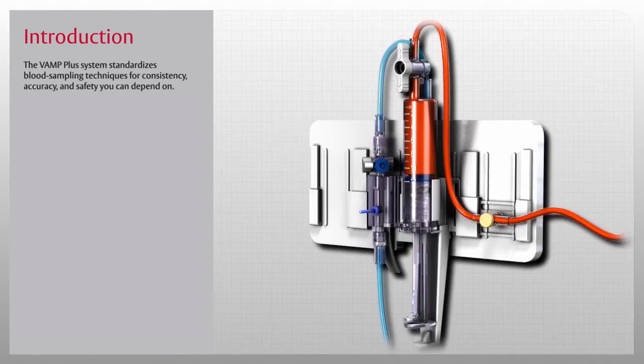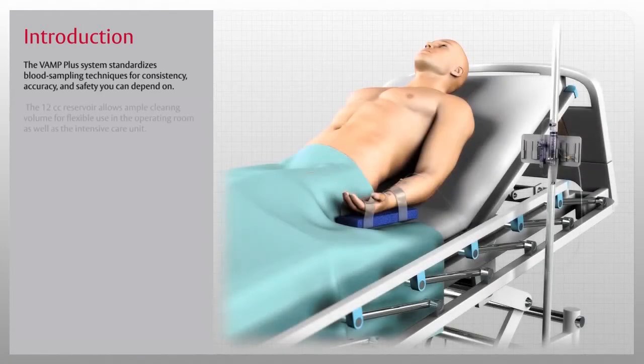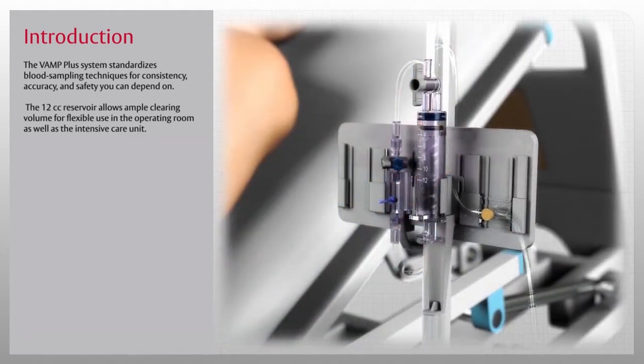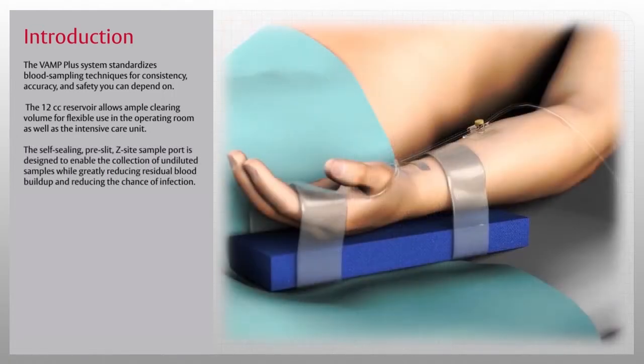Setup, priming, sampling, and flushing are quick and easy with the VAMP Plus system. The 12cc reservoir allows ample clearing volume for flexible use in the operating room as well as in the intensive care unit. The VAMP Plus system reservoir can mount securely on an IV pole for convenient one-handed use.